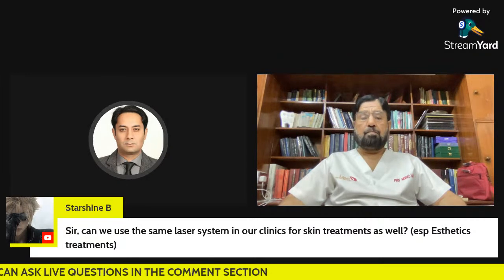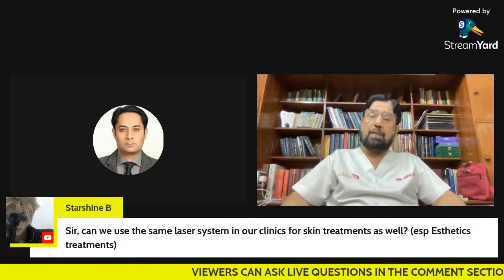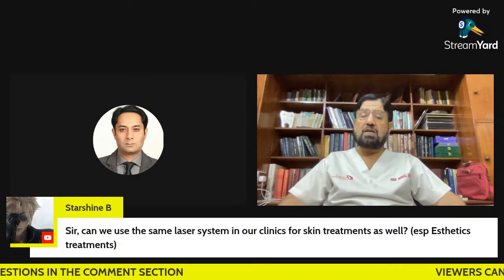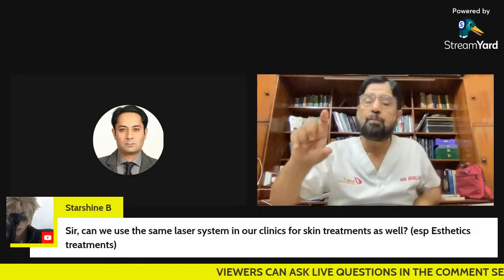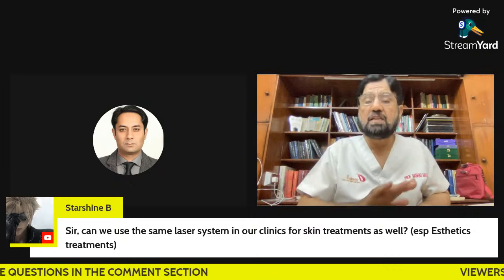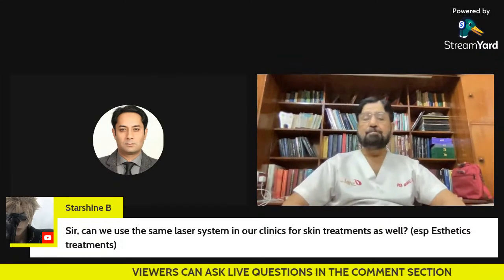Is there any difference in the wavelengths for any treatment, or is it the same? There is a difference of the wavelength as well as the instrumentation. Certain instruments are controlled by the hand and focusing. Certain instruments are controlled by the focal length, by precise focal length measured by its own gadgets. There is a stopper, and it is only the focusing gadget which you can use. These are very special gadgets, and the person is trained and then given formality to use it.